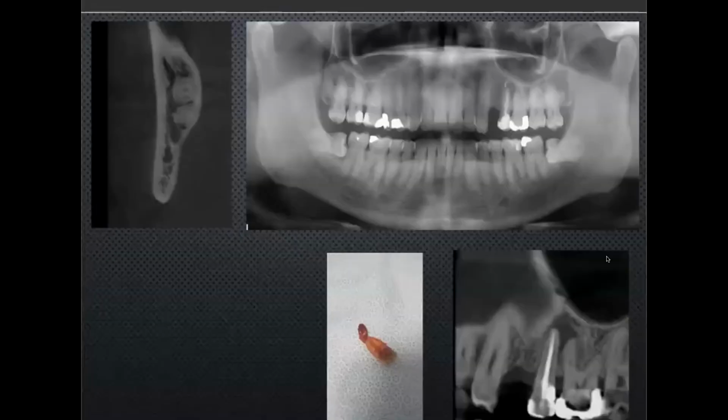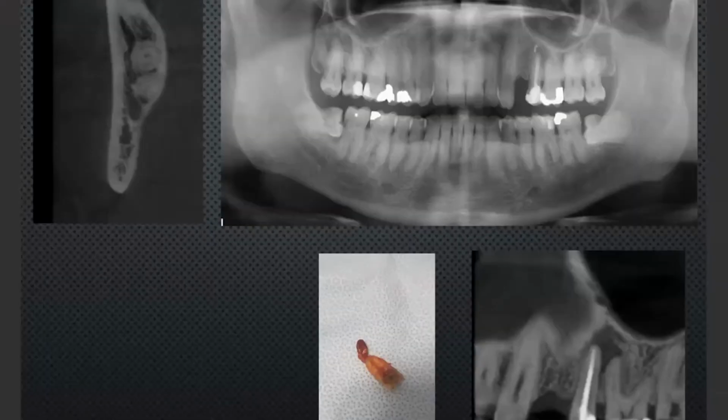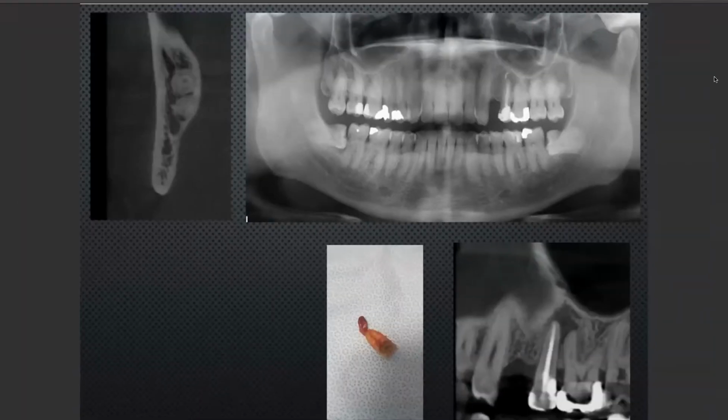Cool. Absolutely. So are you going to put the picture up or did you want me? Okay, great. So essentially, as you can see here, you've got the 2-4 space, where there's obviously a tooth missing, and then the 2-5 is root canal treated. The 2-5 is completely asymptomatic. So the patient comes with an OPG, bearing in mind there's no other imaging.